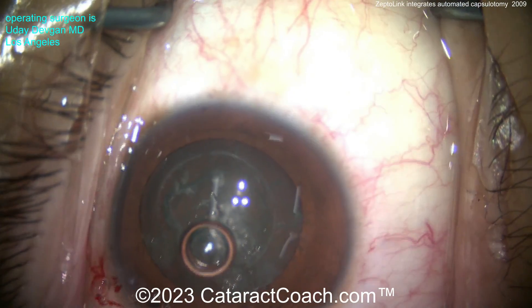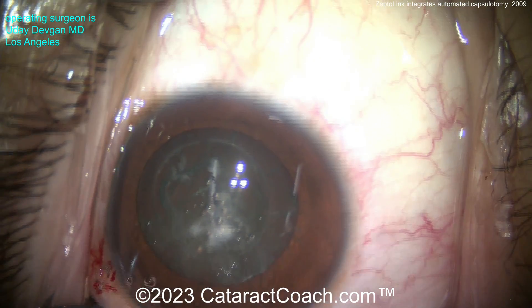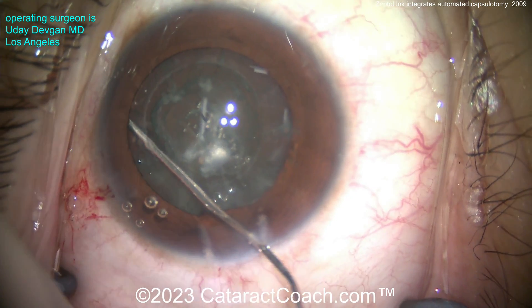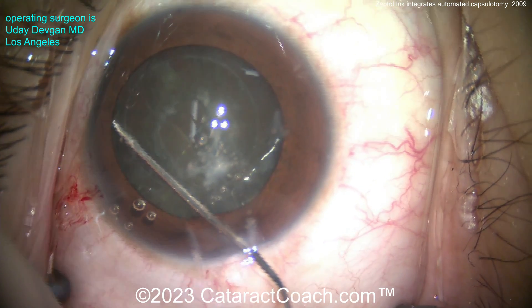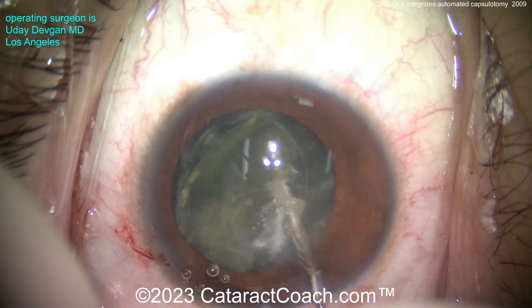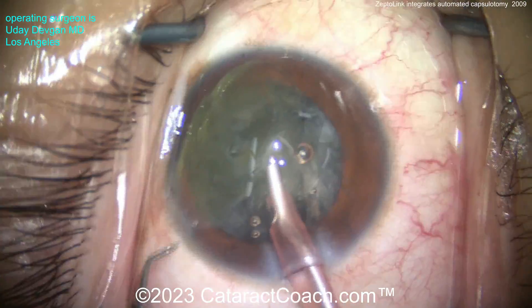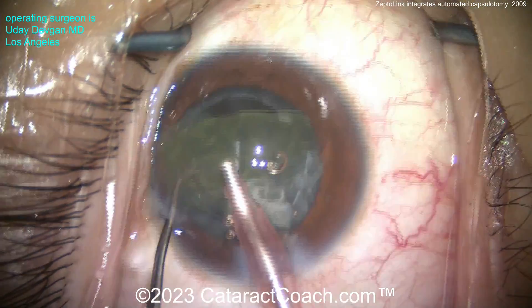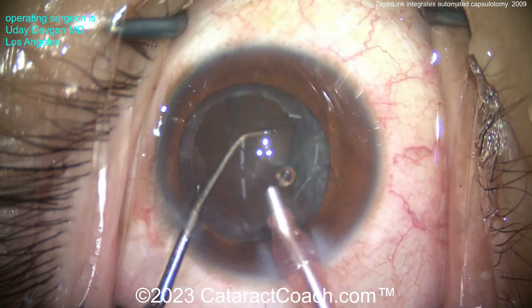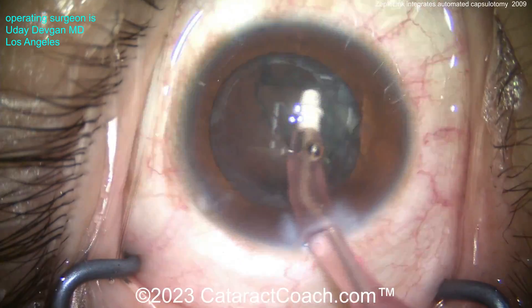We're able to go inside now, pull out that capsule that's totally free-floating, and continue the rest of the FACO. It really simplifies this procedure. This is great for a complicated case like the intumescent white cataract and this scarred anterior lens capsule, but it's also amazing for any routine case because it gives you that consistency of a beautiful capsule opening. You should be able to use all technologies — I'd like for you to have this in the operating room, but also be able to do it with capsule rhexis forceps. We want as many tools as possible in our toolbox to tailor the surgery to the patient.